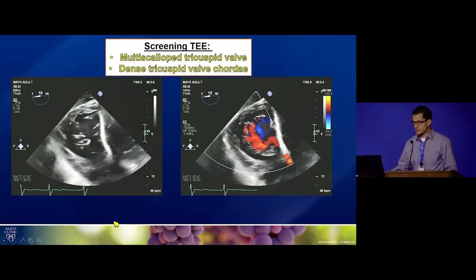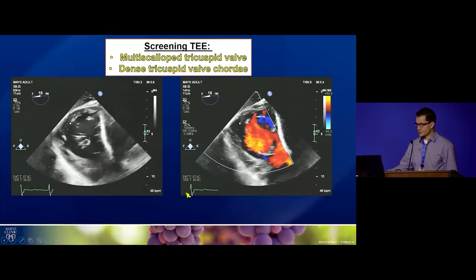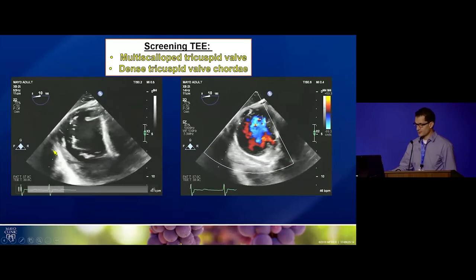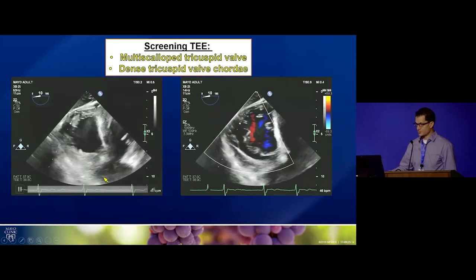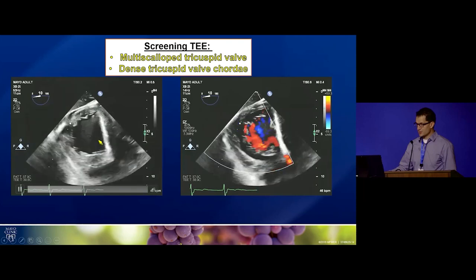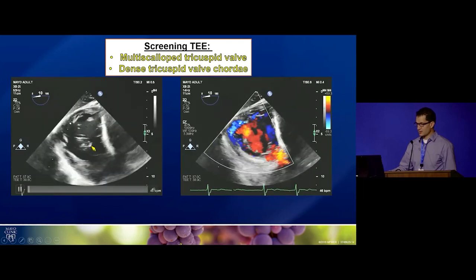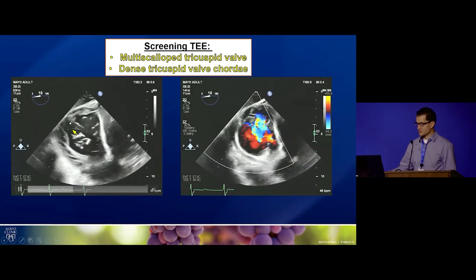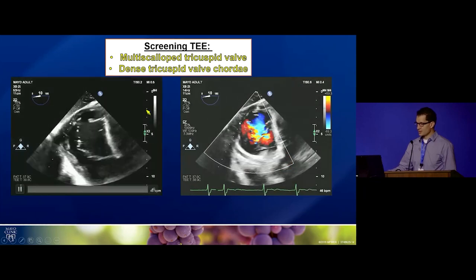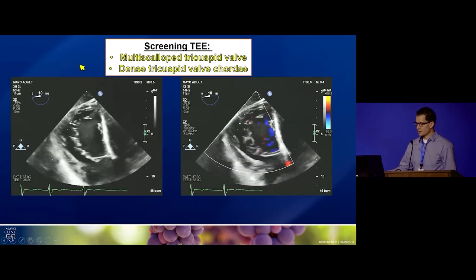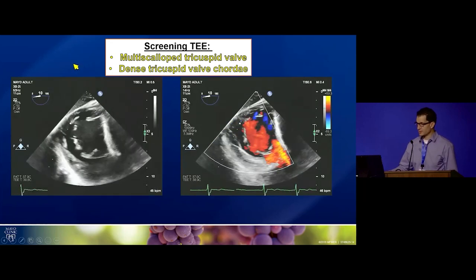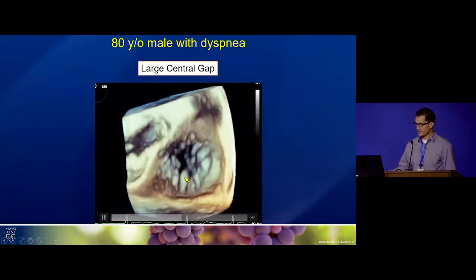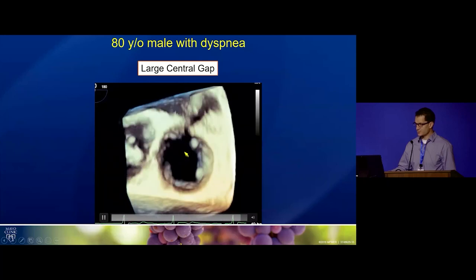Another workhorse view for transcatheter edge-to-edge repair is the transgastric view of the tricuspid valve, obtained by pushing the transducer into the stomach. What you see is a large gap going all the way from anterior to posterior, with a broad jet of TR, a multi-scalloped tricuspid valve, and some prominent cords — all features that were considered less than optimal for edge-to-edge repair.